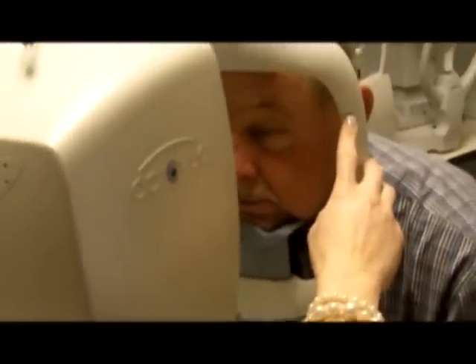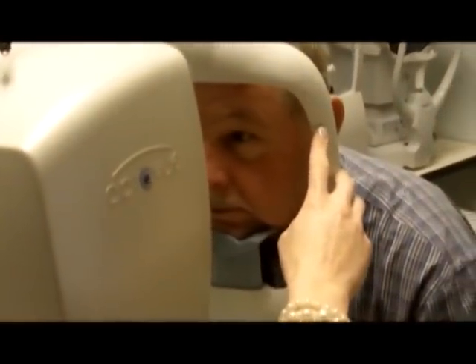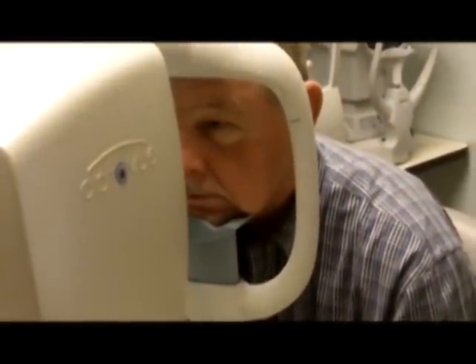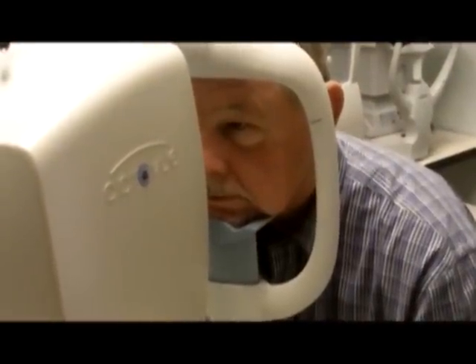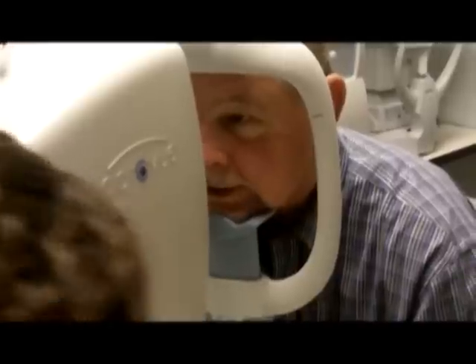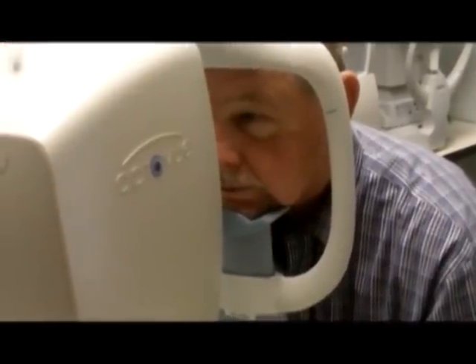I never have the patient in the chin rest before everything is set up, because they're uncomfortable and they'll be sitting there long enough. Now that I have everything set up, I'll have him bring his chin in all the way to the bottom. There are horizontal lines on the side to line up with his canthus. I can see him budging forward and stretching, so I'll lower the table a little bit so he's comfortable.